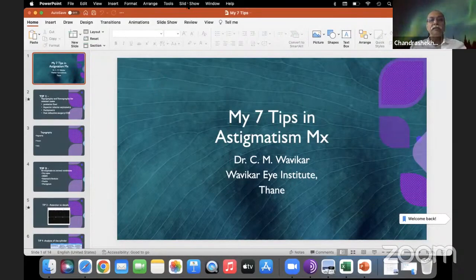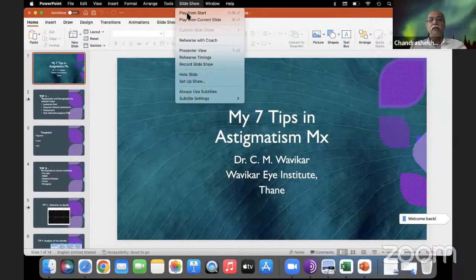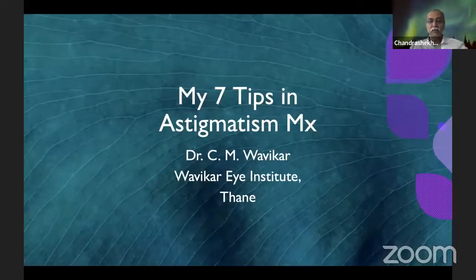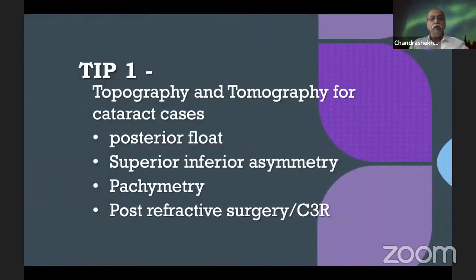It was an excellent presentation by Dr. Harbans Lal sir and also by Dr. Ramesh. There are so many new things which have come up, and sure there will be a good discussion. I have got my 7 tips, but wherever there is a repetition, I'll try to skip that slide or go fast on that. So tip number 1 is, first we should start with topography and tomography.